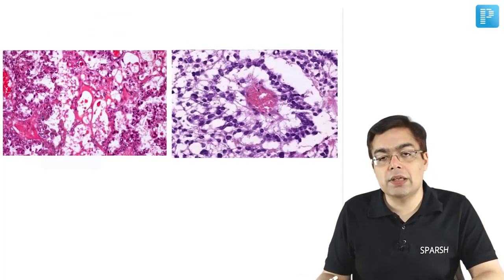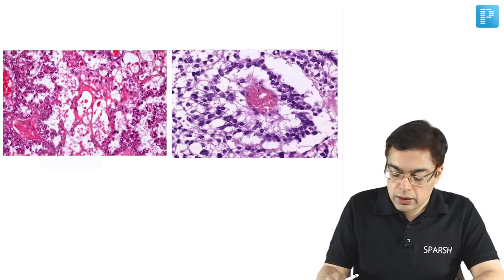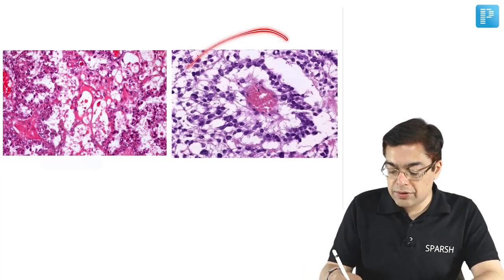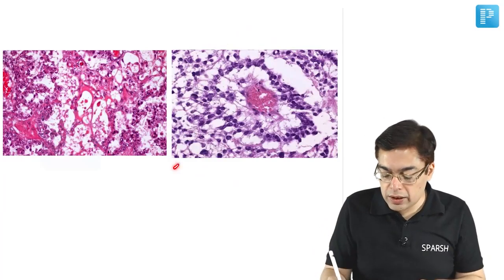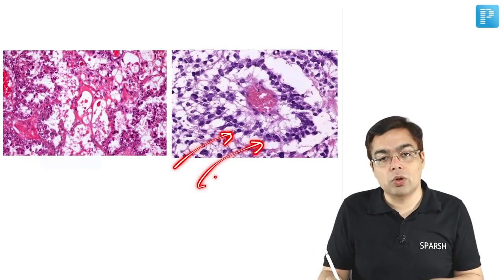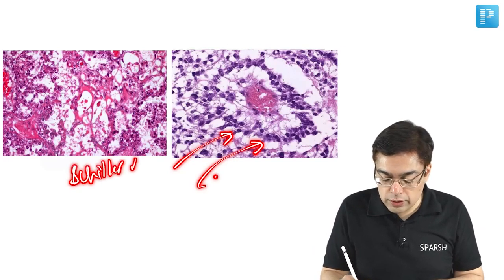Talking about an example of an image which we discussed just a few minutes back with regard to the male genital tract as well: a situation in which there is an ovarian tumor having this kind of characteristic structure. A central blood vessel, a layer of tumor cells, and another layer of tumor cells having an appearance resembling a glomerulus. This is what is given the name of a glomeruloid body, alternatively called a Schiller-Duval body.